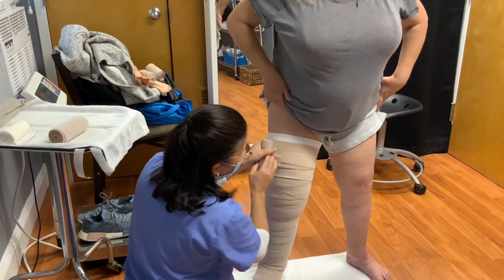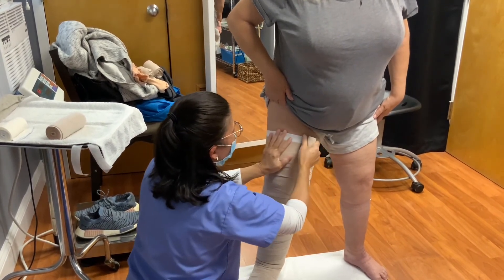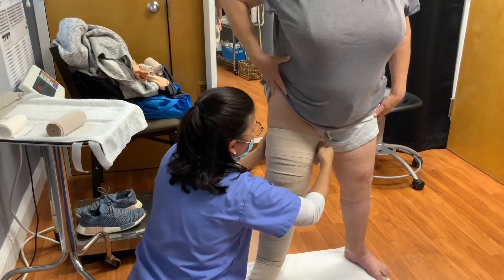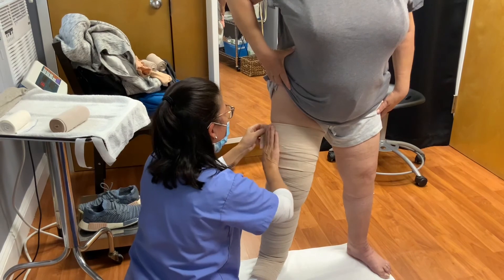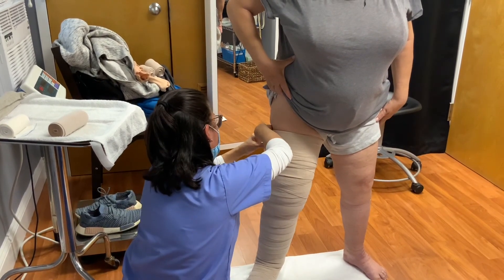Remember — 50% overlap of the bandage. We hold it in place with tape.